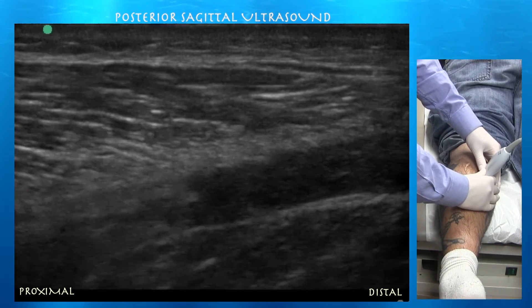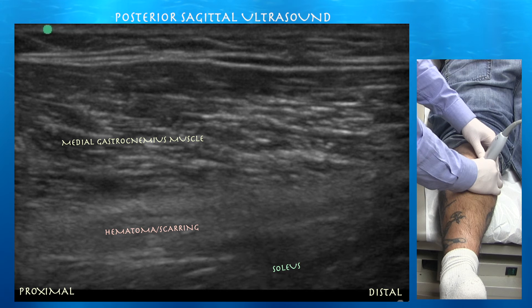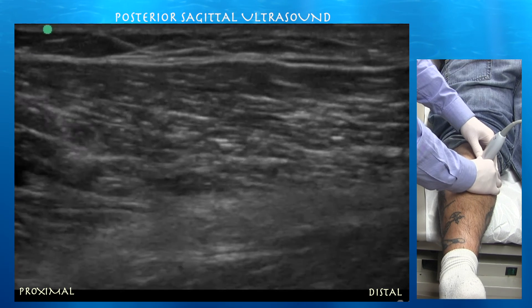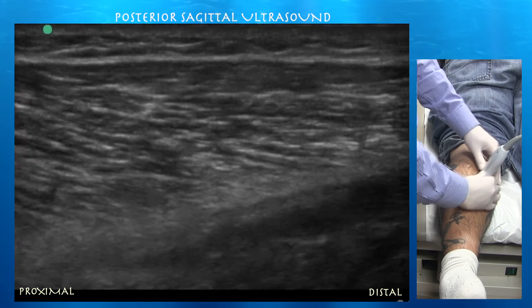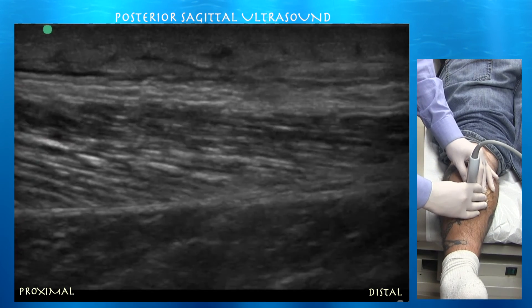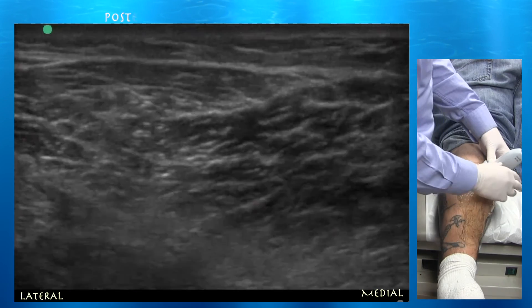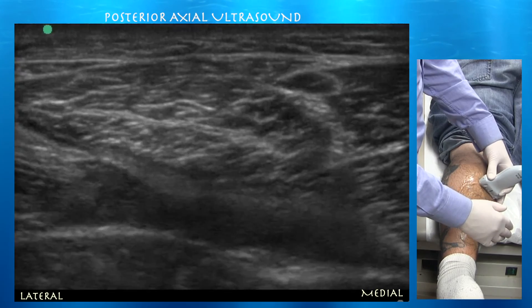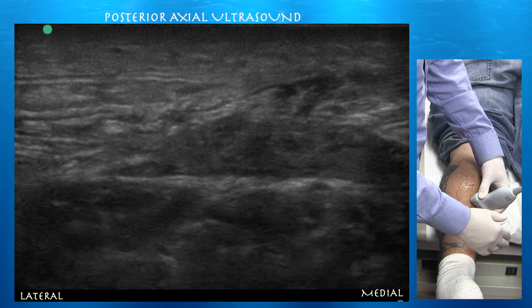Right side of the screen is distal. You can see the organizing hematoma underneath the medial gastrocnemius muscle. The hematoma has become much more hyperechoic, consistent with more scarring and organization over time. It's bright proximally between the medial gastrocnemius and the soleus. Going distally there's still some anechoic signal consistent with residual blood, but there is much more scarring as collagen is laid down forming a scar within the hematoma. The lateral gastrocnemius is tapering nicely and appears normal.